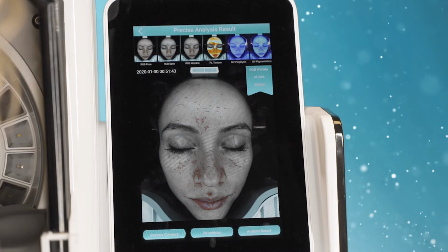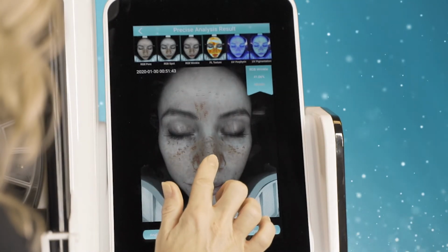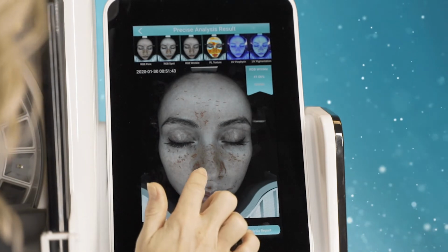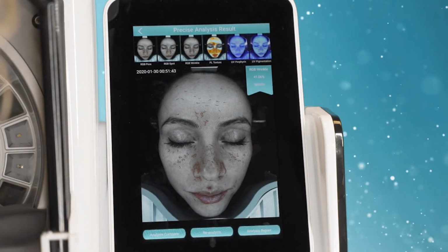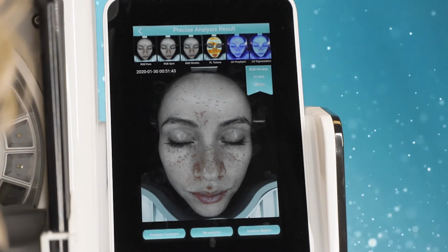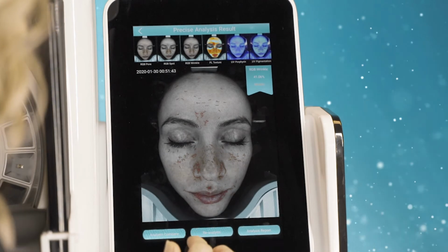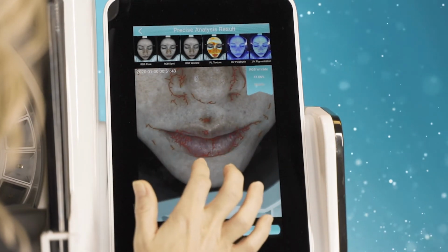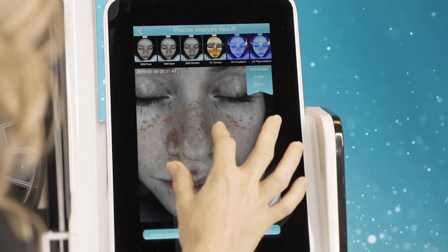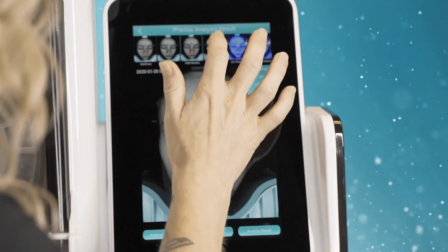RGB wrinkles. The wrinkles on the skin, the laxity in the skin, it's gonna be outlined here. You will notice on the nose, sometimes you'll see some wrinkles. This is caused from dehydration or frequent facial expressions. It's very common to see it on the nose. Also, it's really nice around the lips too. If you're focusing on smoker lines, doing fillers around the lips, it's really nice to outline that.